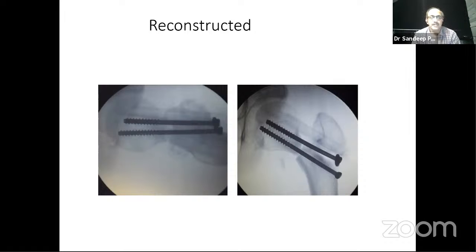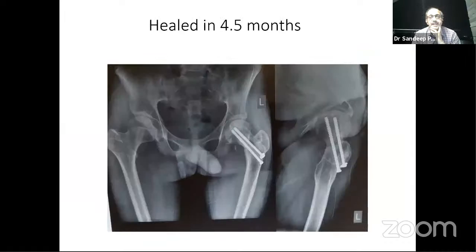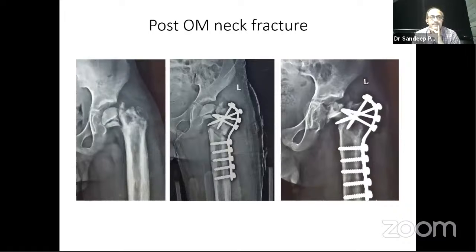I was pretty sure that this is never going to heal because of the neuropathic nature. But to my surprise, this went on to a satisfactory healing, and the bone graft got incorporated so well that today he is walking around pretty nicely. So the non-union got tackled, but again, you can see some patchy sclerosis there and some lysis, maybe some AVN is setting in, but he's doing well, no pain and walking around nicely.